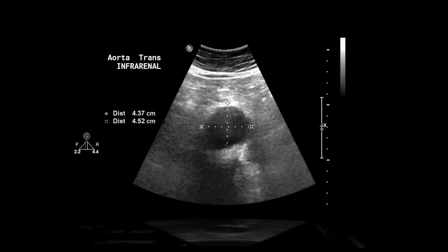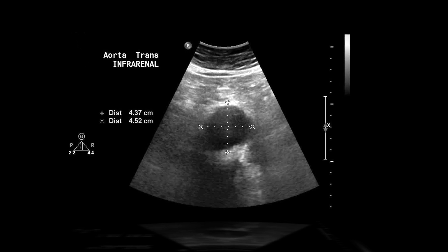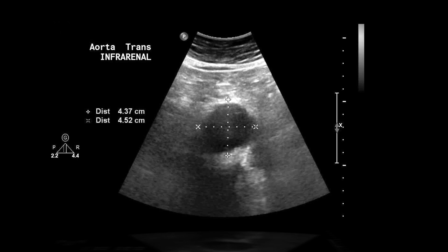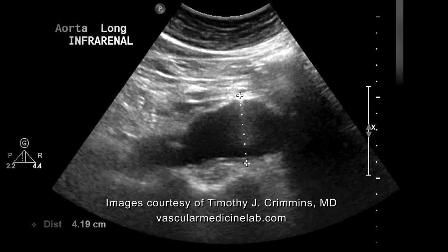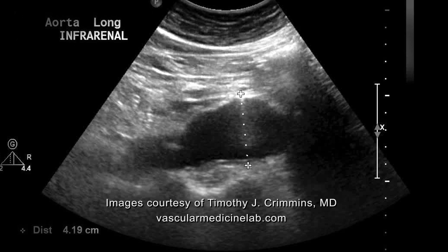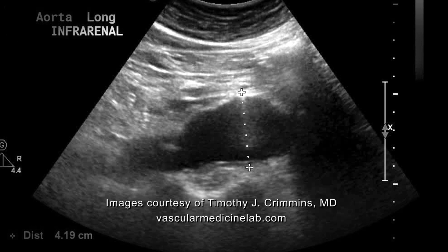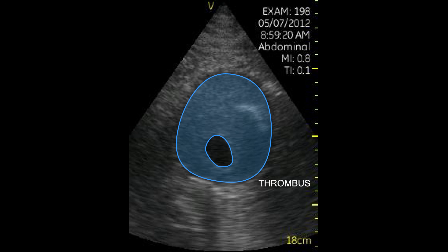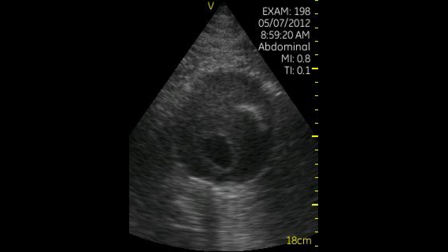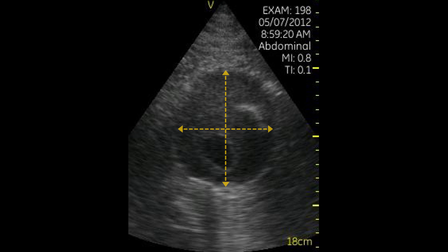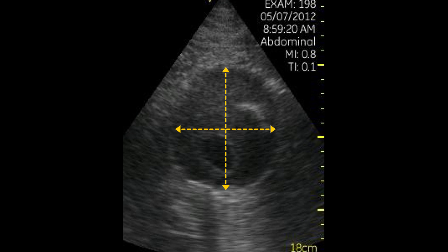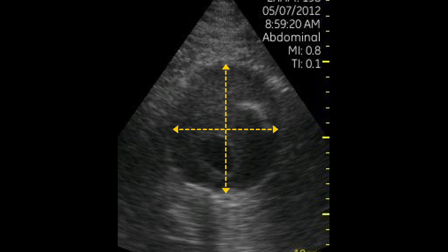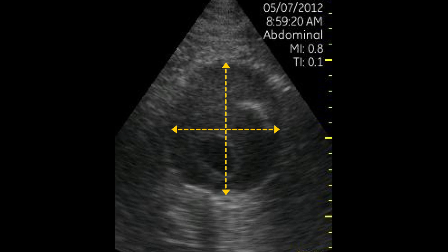If an aneurysm is detected, then additional images should be obtained in the transverse and longitudinal axis of the dilated segment. Measure the aneurysm at the point of maximal dilatation. Sometimes a thrombus may be seen in the abdominal aorta. In such situations, the abdominal aorta should be measured from outer wall to outer wall and should include the thrombus as well as any plaques within the measurement.